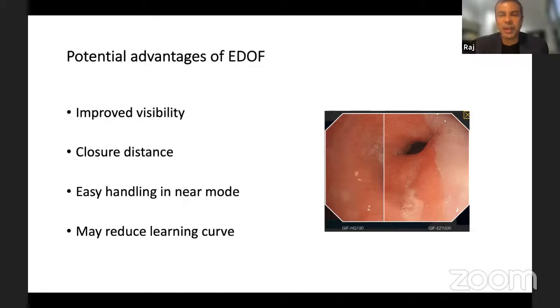So imaging forms a very important part of this, or learning how to interpret what's seen once we have imaged something. We've talked about this yesterday and today, but it is so important that we understand what we're looking at. But certainly the ability of the individual to move the scope and to focus on something will improve considerably with this EDOF function.